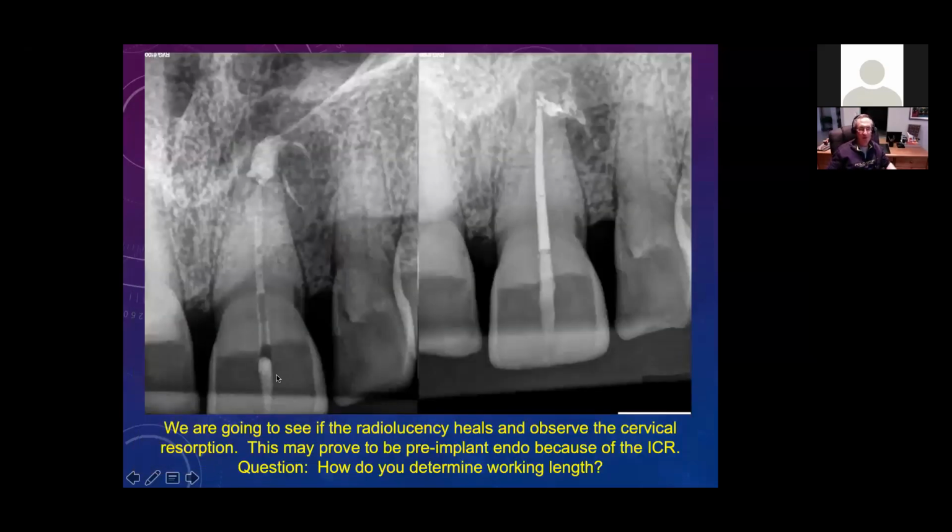So we started the root canal treatment, and again, I got a little carried away with the calcium hydroxide. One of the things I want to point out is how conservative this is too. Conservative access, conservative shaping. When you have a small canal, there's no reason to prep it to a big size. All you're doing is weakening the tooth. There's no reason to make a great big old access here. Trying to leave as much of the tooth behind as possible.